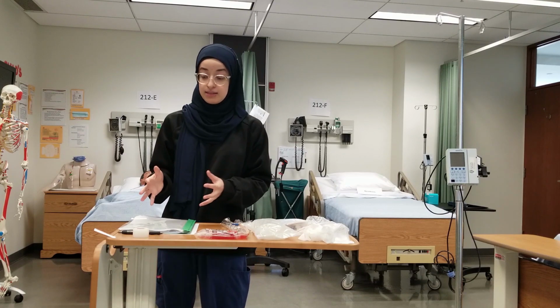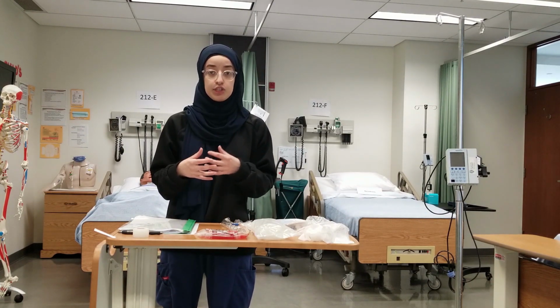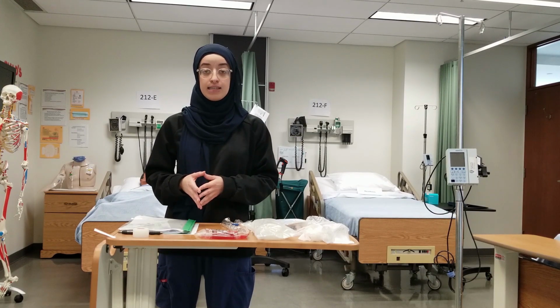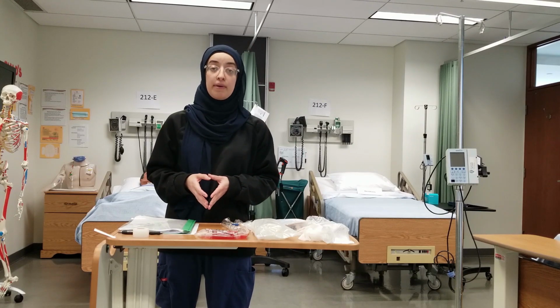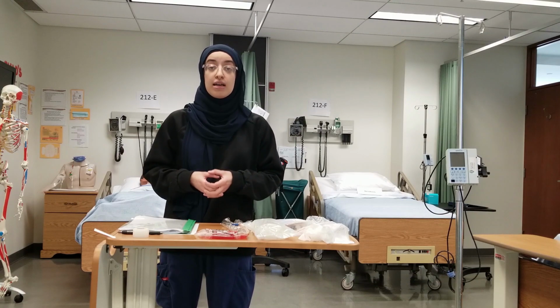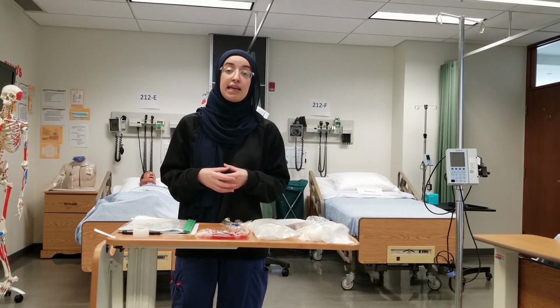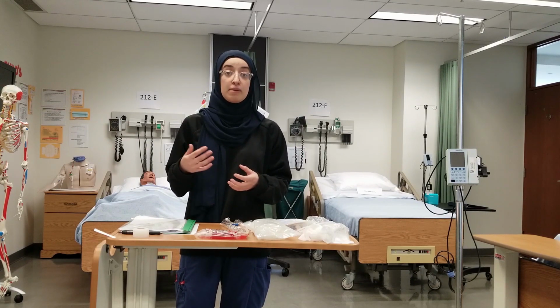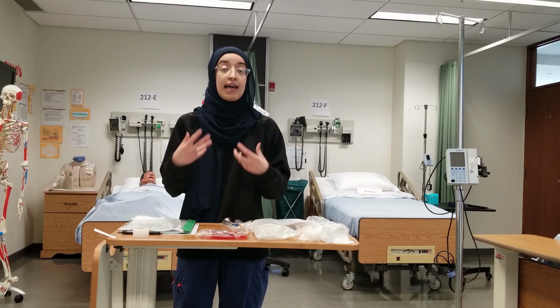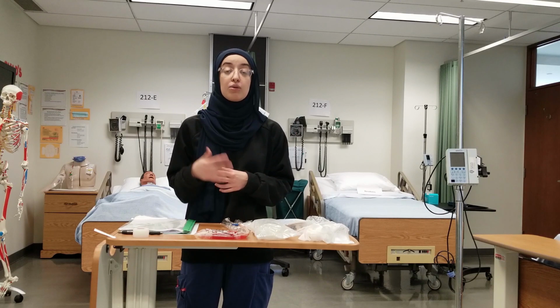One other thing that's stated in the policy is that we want to use an IV that is efficient for the purpose of giving blood. So typically anything larger than an 18 gauge needle is preferable for blood products. The reason is that an 18 gauge or larger needle has a big enough diameter to infuse blood at a rapid rate if need be. A lot of times patients who need blood, for example, patients in motor vehicle crashes or trauma cases who are bleeding heavily or are in emergency situations, we need to get blood into their body very quickly, so at very high rates.